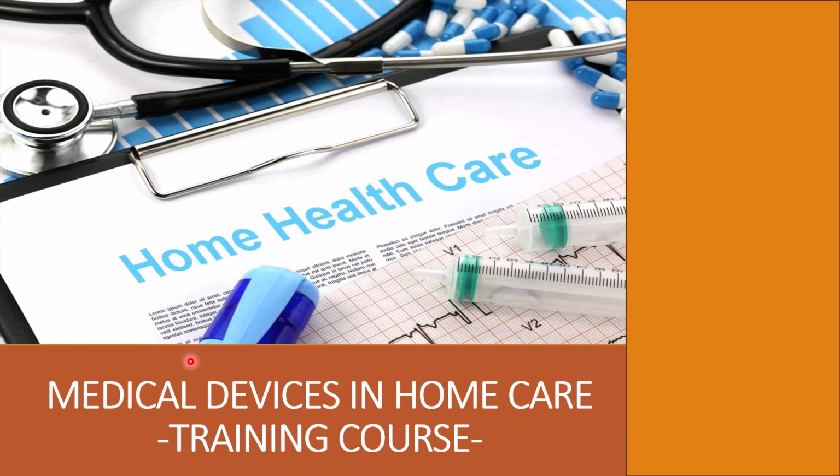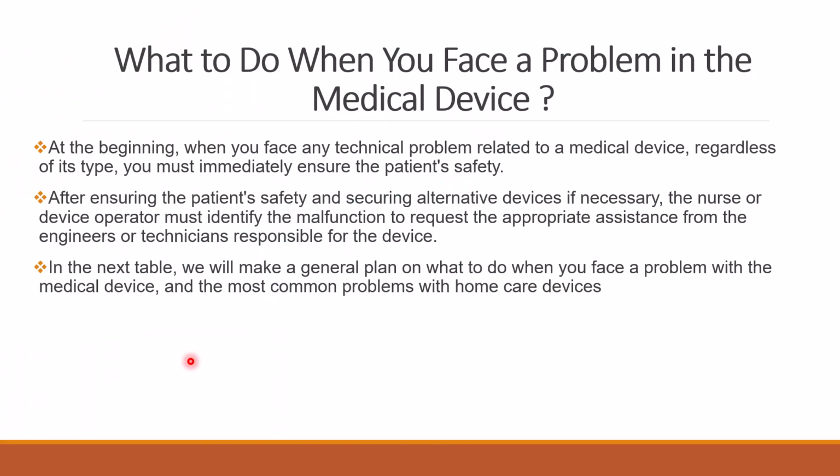So it's important to understand the working principle of the device, and after that you will be able to handle it in a more comfortable way. So what to do when you face a problem in any medical device you are using at home or in the hospital? At the beginning, when you face any technical problem related to a medical device, regardless of its type, you must immediately ensure the patient's safety. The patient's safety comes first.